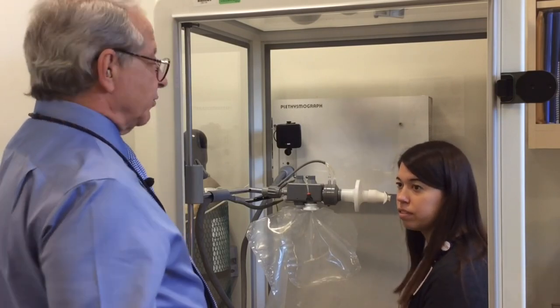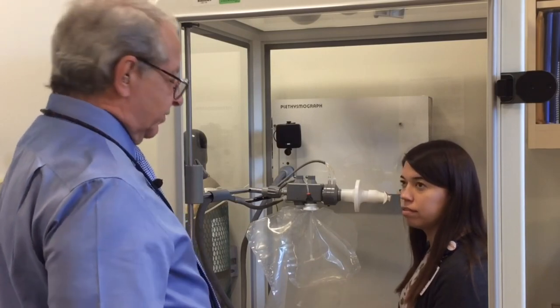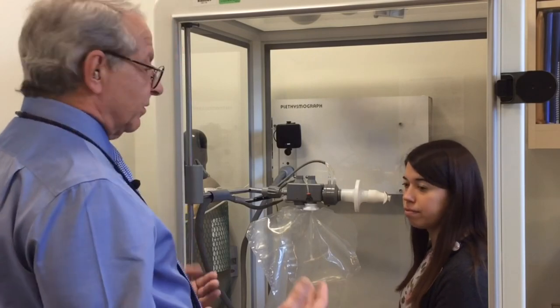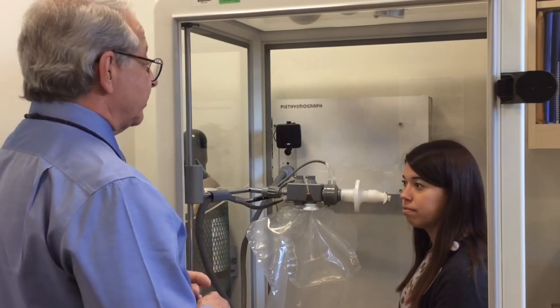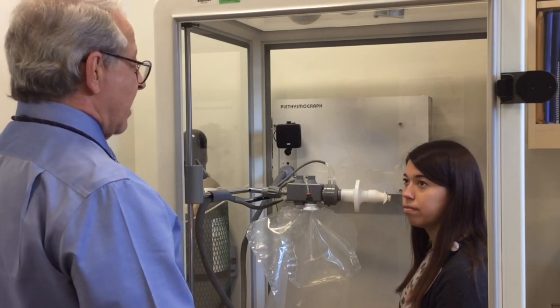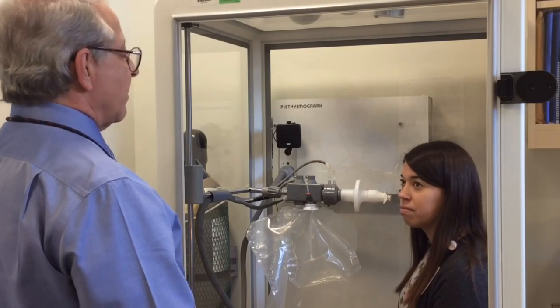And so what we're going to do is, we already know that she knows how to use the mouthpiece and put the clips on. So she's situated in the chamber, and I'm going to explain to her that I'm going to close the door, and we're just going to wait 30 seconds for the pressure and temperature inside this chamber to settle. Once that happens, I'll signal you and tell you to put your nose clips on, mouth on the mouthpiece.